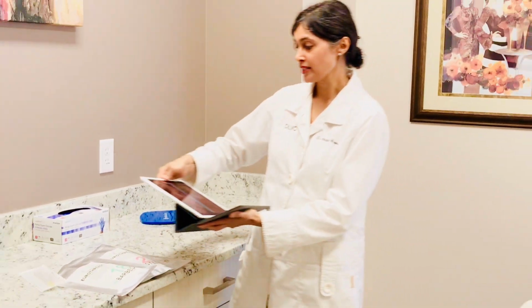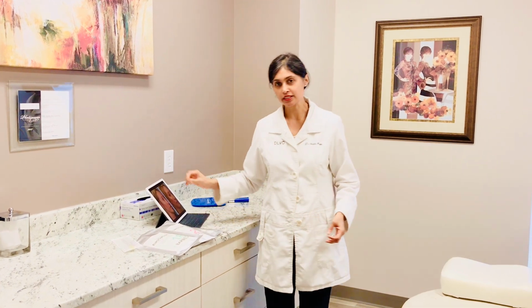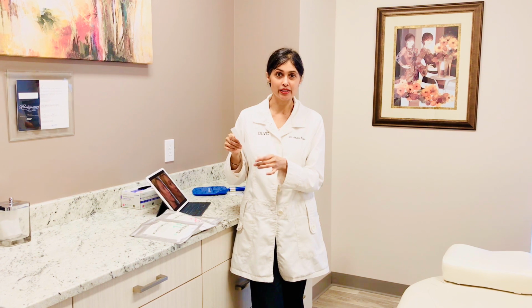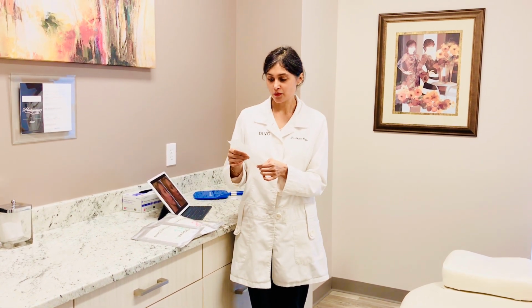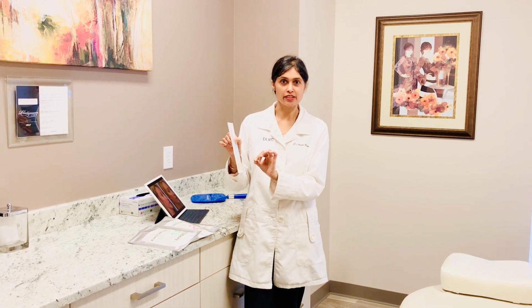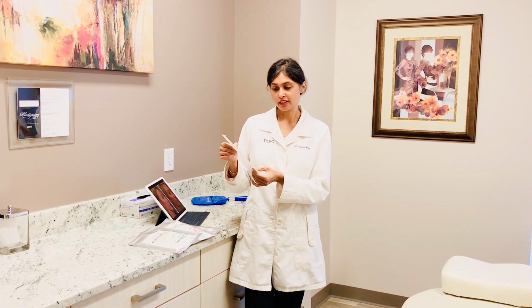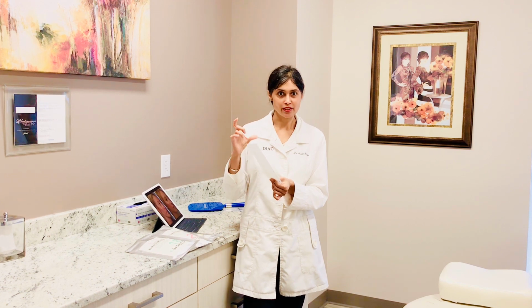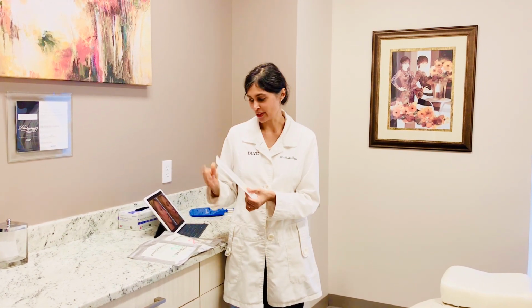So the threads are very safe. They are done strictly under local numbing. So usually the point where the thread is inserted, I put a little bit of lidocaine locally, and then a little needle is poked through the skin. This needle creates an opening large enough for the little cannula to go through. So the cannula is threaded through a path that is pre-marked and pre-designed. And once we reach the end of where the thread needs to go, the needle is twisted a little bit, it releases the thread, and the cannula is pulled out, and the thread remains in place. And we can do that pretty much anywhere on the body. Sometimes with the Nova threads, we're using like 20, 30, 40 Nova threads at a time, whereas on the face with the PDO threads, it's not quite as many threads all at once.